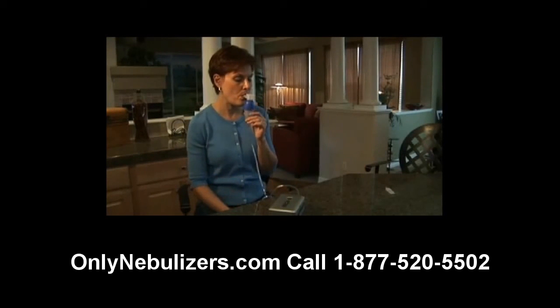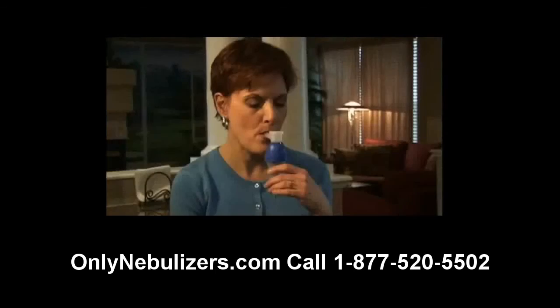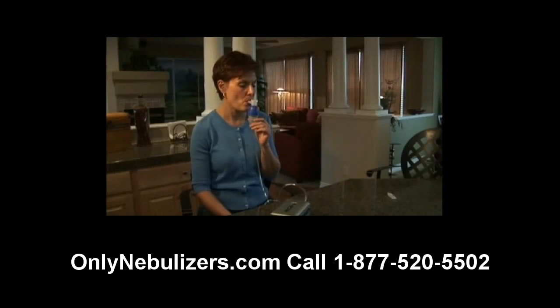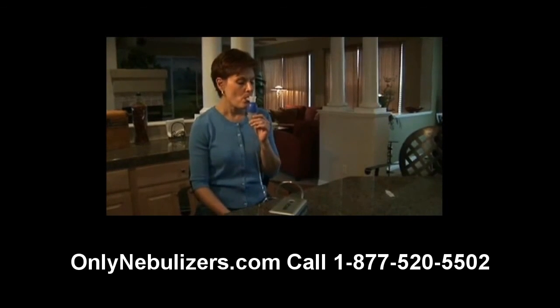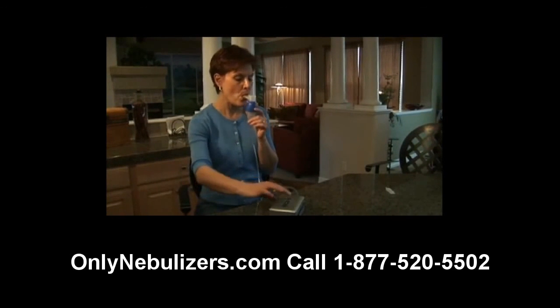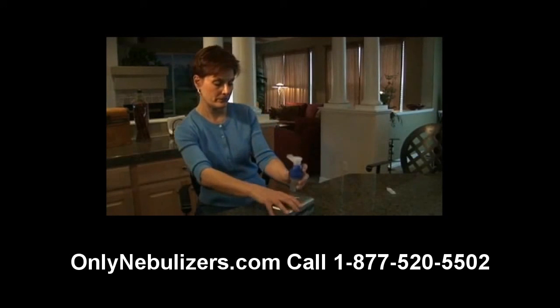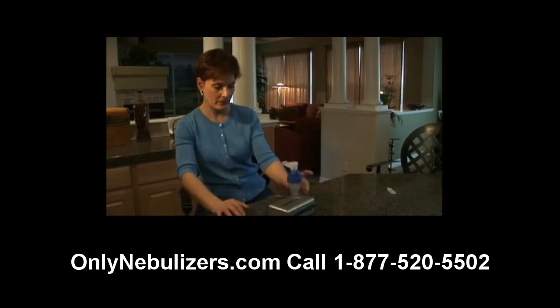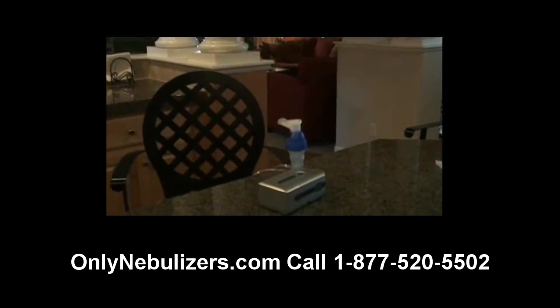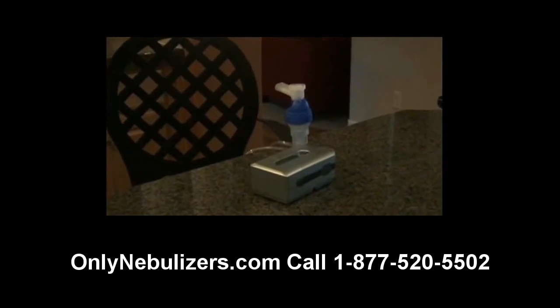You're now ready to begin treatment by turning the compressor's power switch on and placing the mouthpiece between your teeth. With your mouth closed, inhale deeply and slowly through the mouth, then exhale slowly through the mouthpiece. If you need to interrupt treatment, simply turn off the power switch and place your nebulizer into the holder on the traveler. Please note that you may need to use the nebulizer holder adapter bracket to accommodate your nebulizer.